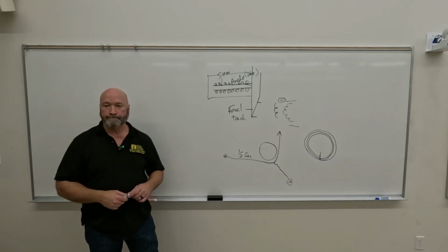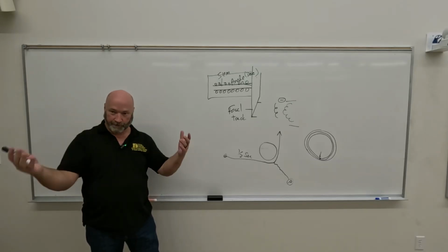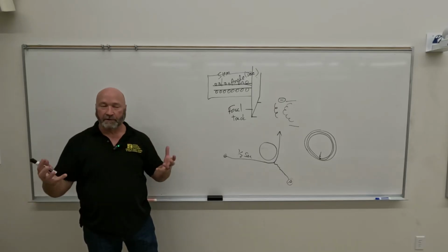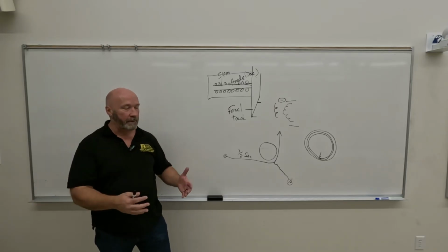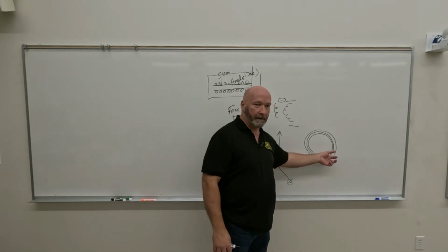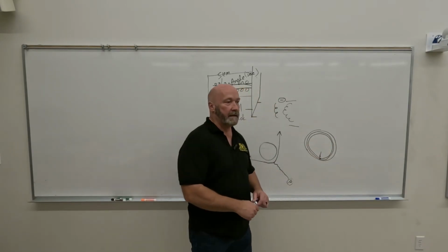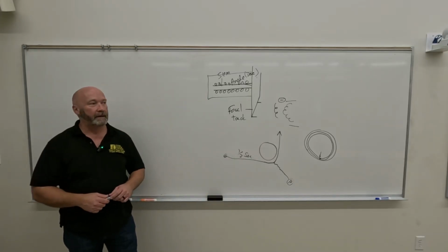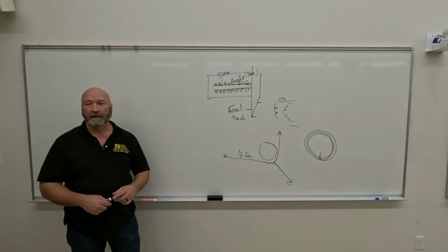So what's the purpose for rotating as fast as we do? Getting rid of heat as fast as possible. We're spreading the heat out as quickly as possible, right? So we're spreading it out so fast that we don't get to a point where we're going to melt the anode in a specific place. It doesn't have as much time to heat up. We use this in a lot of things.